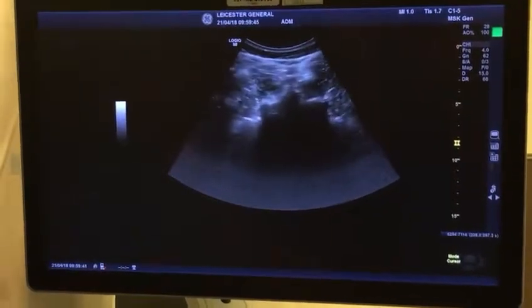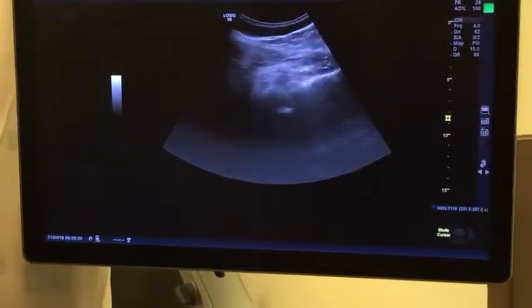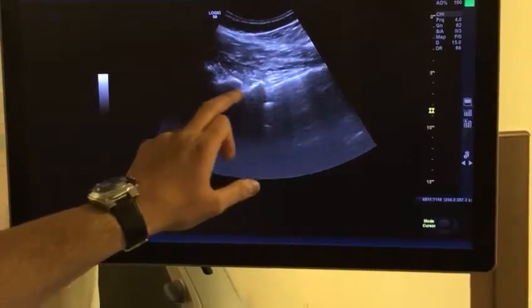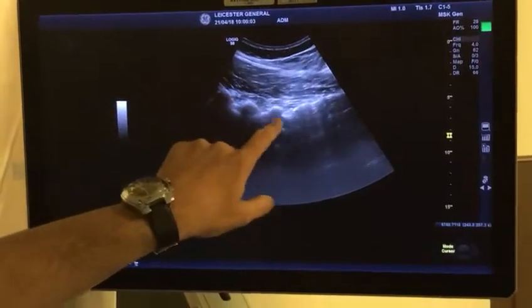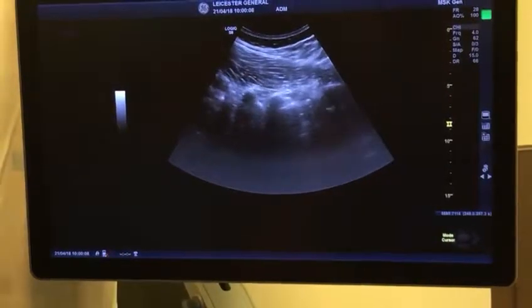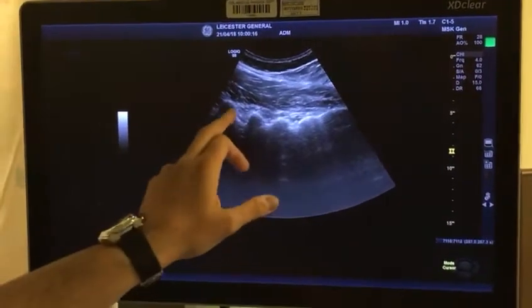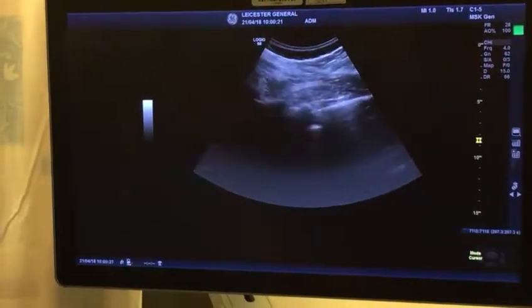So how to calculate the level? You just look for the sacrum. They talk about various views. If you're talking about the longitudinal views, there are 3 views. This is the articular pillar view. It's also called the horse head appearance. If I keep moving laterally, transverse process. This is the trident view, the transverse process. In this case, the distance between the articular process and the transverse process is not that long, and the transverse processes are very short. So trident view, keep going medially, articular view.